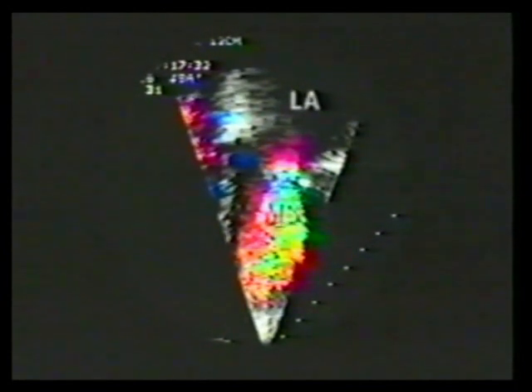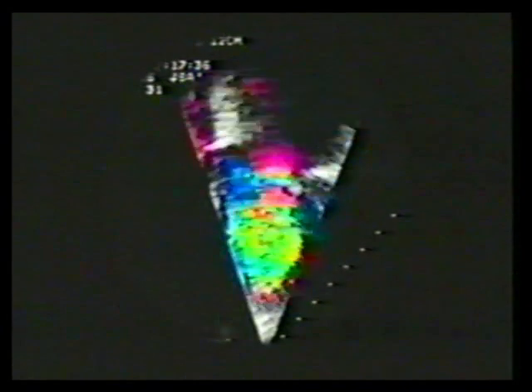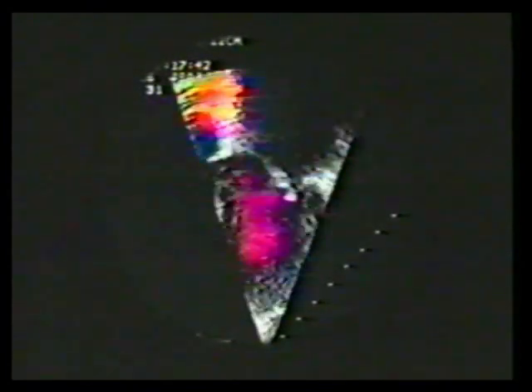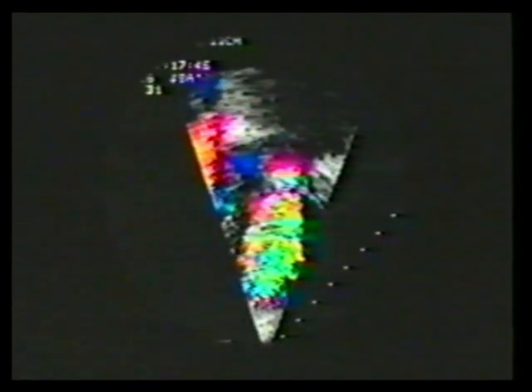This 48-year-old female has severe mitral stenosis. We will use her pulmonary acceleration time to assess the degree of pulmonary hypertension.